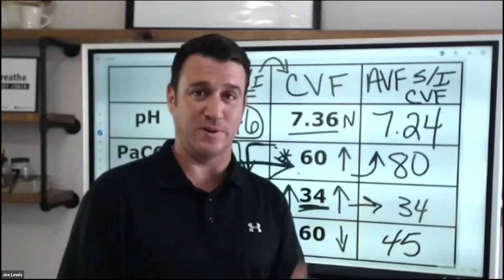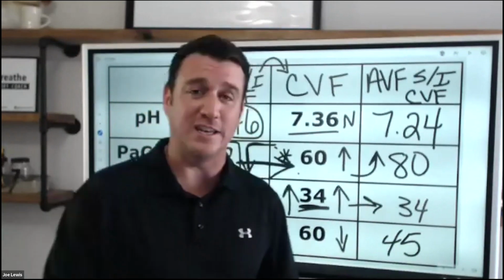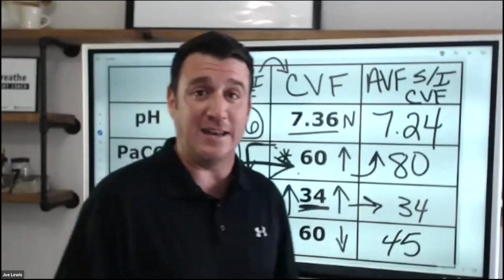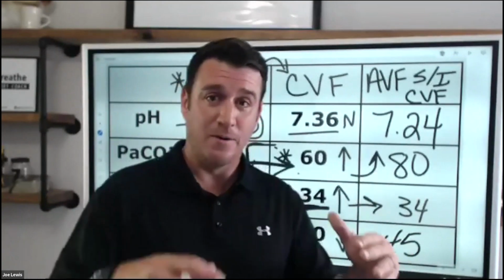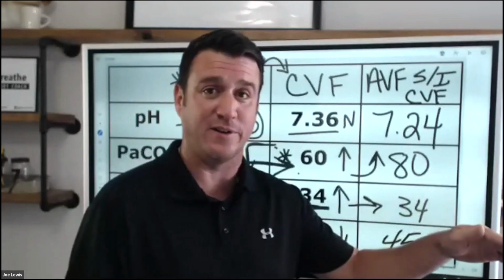How many times, respiratory therapists, raise your hands, put it in the chat, something. How many times have you seen a COPDer come in with a CO2 of 80 and 8 hours later, we've got a CO2 of 40? Yeah, right? We said, well, we've got to normalize CO2. We've got to get 35 to 45.